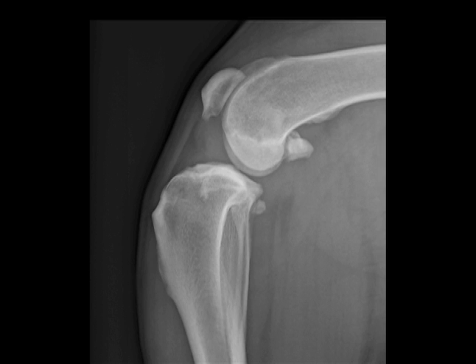I've got an x-ray here to show you. What we see is fluid accumulation and/or scar tissue within the joint that shows up as a gray mass effect in the joint. We see bone spurs on the end of the patella very commonly. Those bone spurs are not causing a problem, but they're a sign that the joint's chronically inflamed, and 99% of chronically inflamed canine stifle joints have ACL disease.